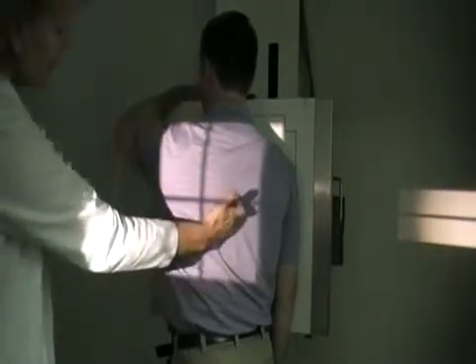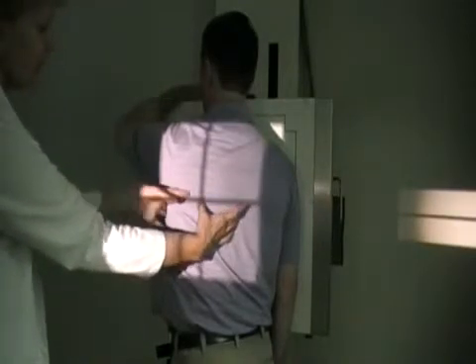So to do the left oblique, or the left ribs, we're going to get the patient in an RAO position. The left side is farther away. The patient is at an angle of 45 degrees. Our longitudinal line is going to fall halfway in between our lateral border and the spine. So there's our halfway point. Transverse is going to cut across the inferior tip of the scapula. And since we're going for the left side, we will place our left marker right up here in the corner. And again, you would do this on deep inspiration so that you can see more ribs above the diaphragm.